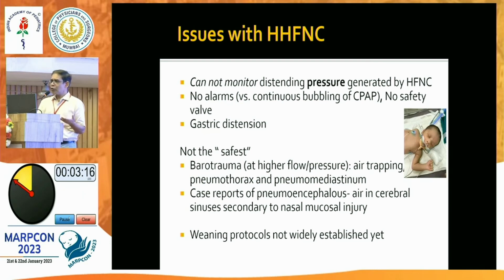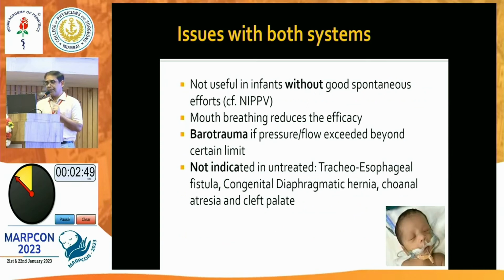This also can cause distension. And it is not the safest, because with higher flows, you can get barotrauma as well. There are case reports that a nasal prong has caused injury to the nasal septum and also pneumoencephalus, that is, air in the cerebral sinuses. And since it is a relatively recent and newer modality, the protocols for weaning have not yet been established widely.